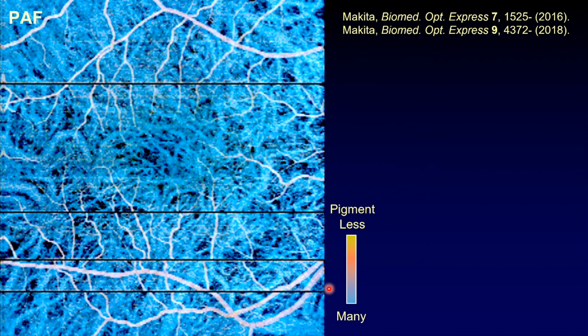Okay. So now we can distinguish the retinal vessels and the vessels beneath the retinal pigment epithelium, namely the choroidal vessels. If there is an intact retinal pigment epithelium, the retinal vessels appear in hot colors, and the choroidal vessels should appear in cold colors, blue. But in the case of a pathologic eye, this rule cannot be applied, surely. That's something we would like to see.